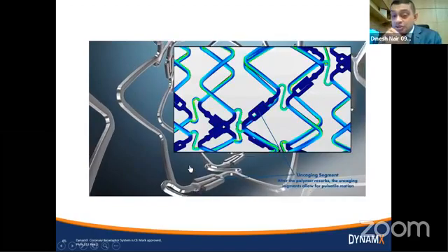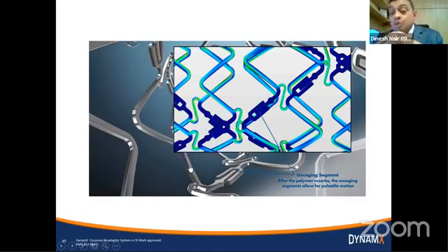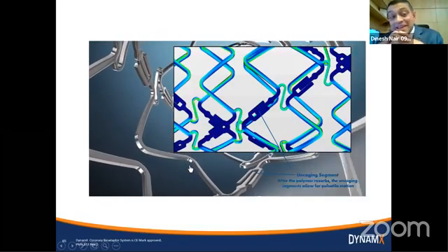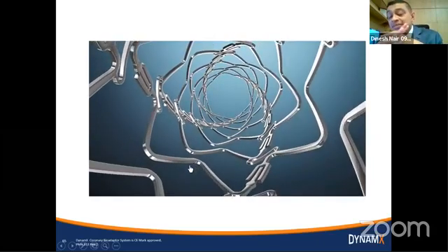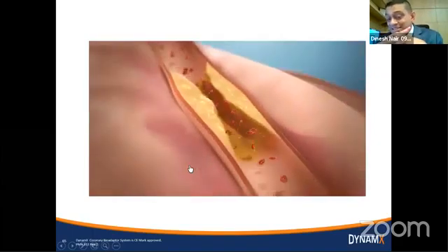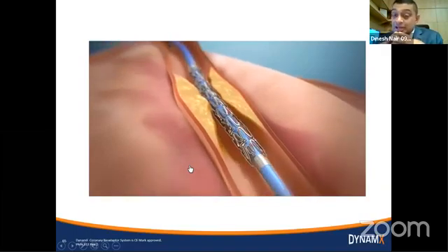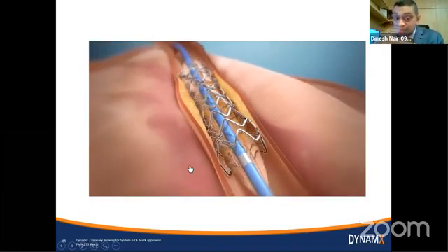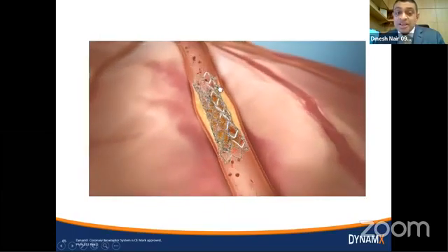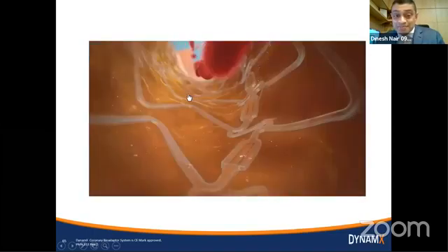These polymers dissolve over time, allowing that hinge to move and allowing the artery to move, not perfectly perhaps, but a little bit more the way nature had intended it to be, and therefore reducing the risk of abnormal shear forces within that stented segment and potentially reducing the risk for blockages getting worse over time and the need for re-intervention as well. But what you see here is drug being eluted, the little particles, and then after that, healing with a new layer, neointima, inside.